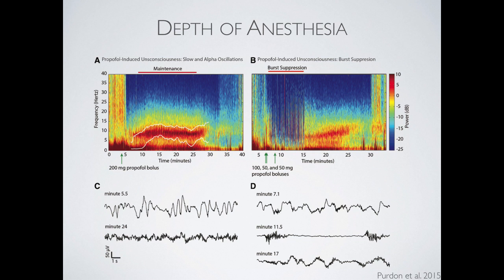So here, in this case, you're seeing at the bottom the time domain representation of these EEG signals during an anesthesia operation. This is actually an experiment, excuse me. And here you can see how the spectrogram representing the relative contribution of these different low-frequency and high-frequency components changes as the brain goes from unanesthetized, fully conscious, to drowsy, to completely anesthetized. And this drowsy state is what we see here. It's called a maintenance activity. This is dominated by that 10 hertz alpha rhythm again.